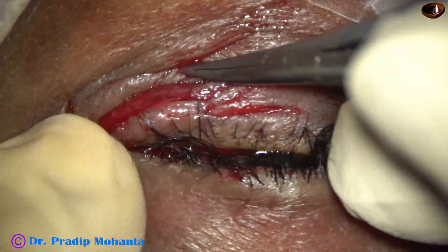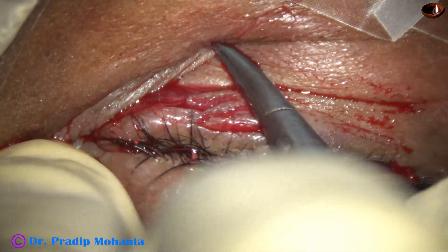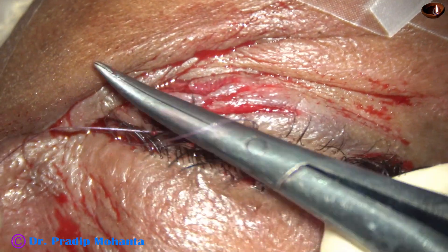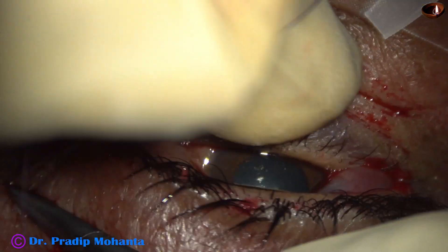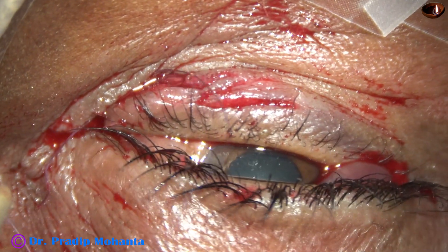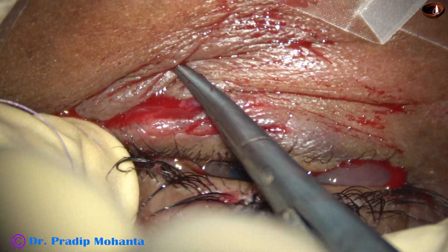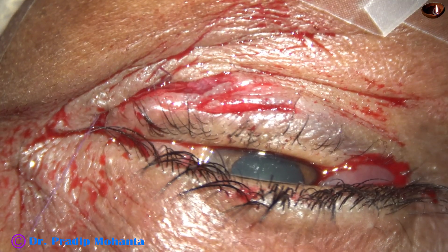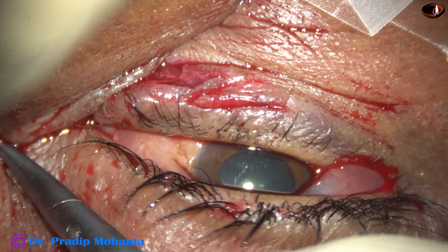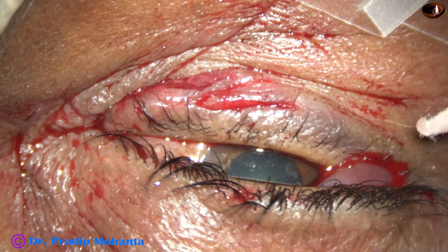So, this is the first two throws. Must pull it firmly, but not so strongly that the thread gets torn. And then, one more throw. And finally, one more throw. This may be one more throw in this case, because this is a very important suture. So, four times total: first time two throws, and then one more throw for the next three times.